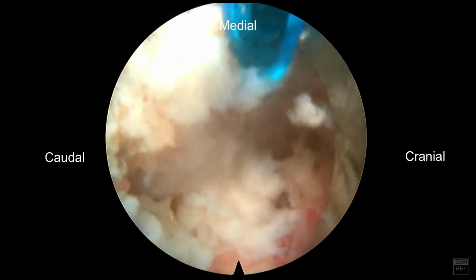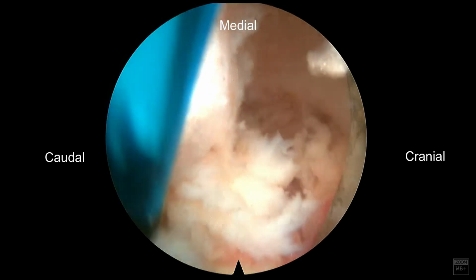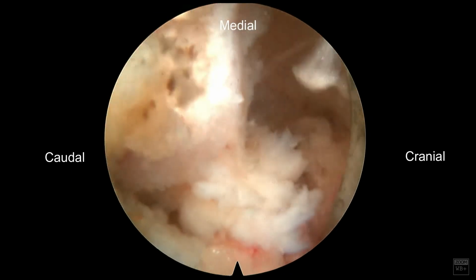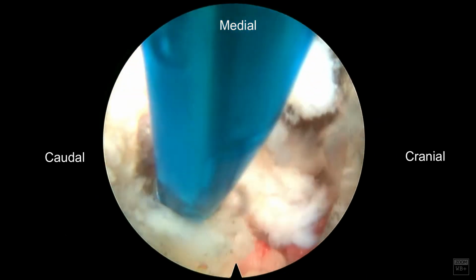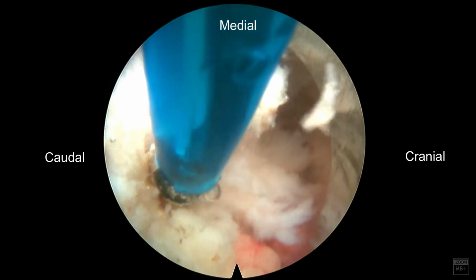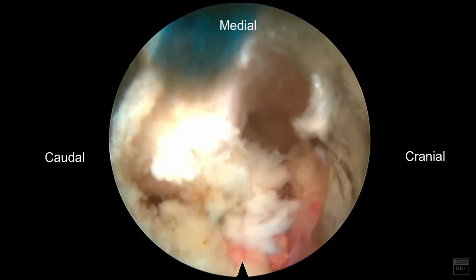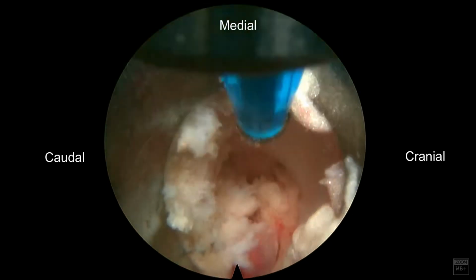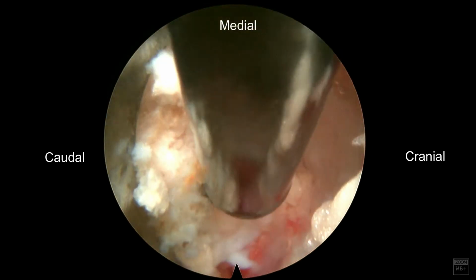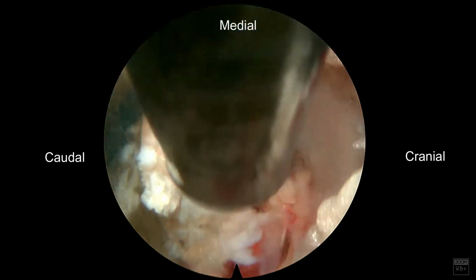I'm trying to remove some of this ligament attachment from the facet joint. And that's really what you see on the MRI that I showed initially, and that's where you can get some foraminal compression when people stand. They most likely complain of leg pain when standing, and so the foraminal area gets smaller and causes compression radiculopathy.